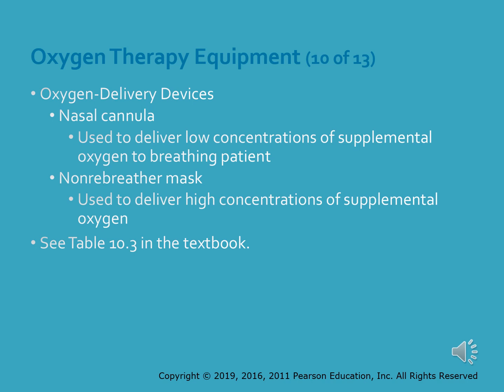Next is the non-rebreather mask. The non-rebreather mask is used when the patient requires a higher concentration of oxygen other than what the nasal cannula can deliver. The non-rebreather mask consists of a face mask, a one-way valve, and a reservoir bag. The reservoir bag must remain full and will ensure that the patient receives the highest possible concentration of oxygen. It is important that you inflate the reservoir bag before placing the mask on the patient's face.